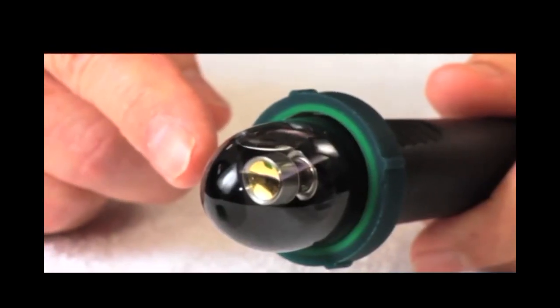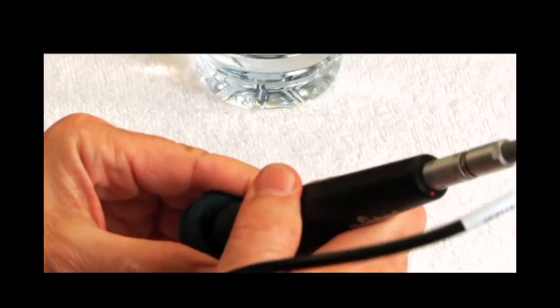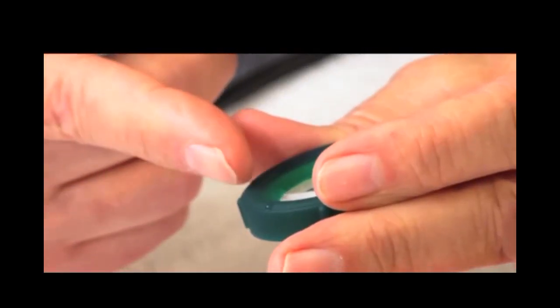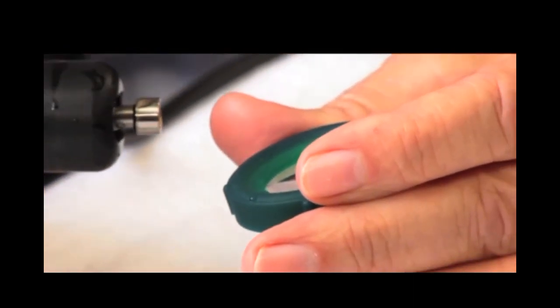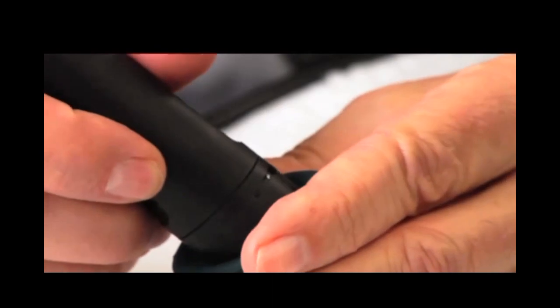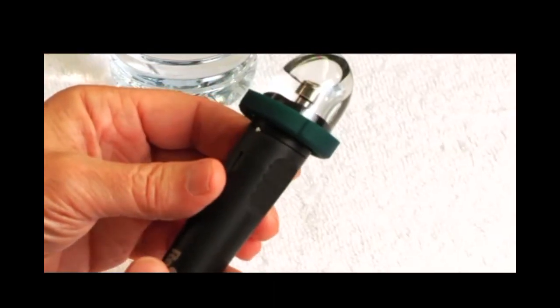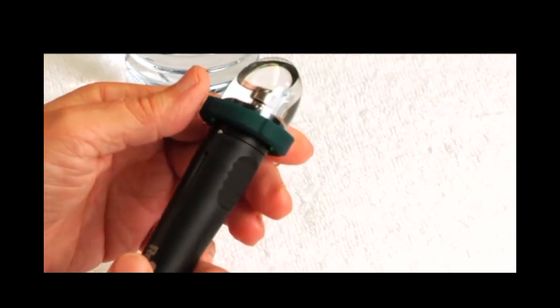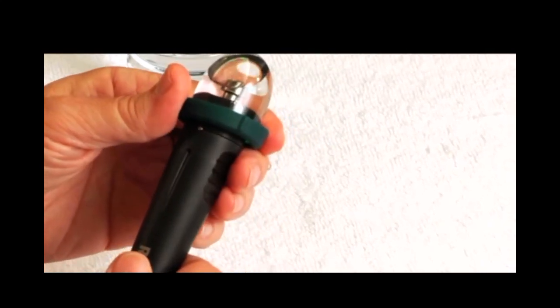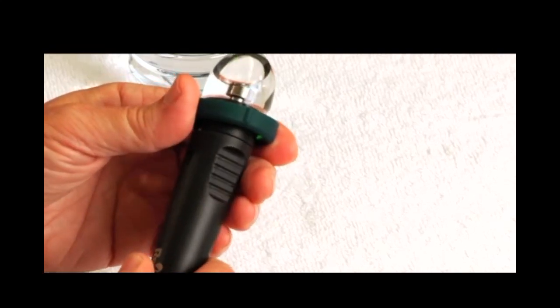There are 3 ways to alter pressure within this bag. One is you can change the fill amount. Instead of filling all the way up to the collar, you can put less fill in and push the probe in further. You can adjust back and forth that way, the fill pressure. A second way is to look on the side here. I can change pressure by inserting this further into the bag. I can lower pressure by pulling it out.